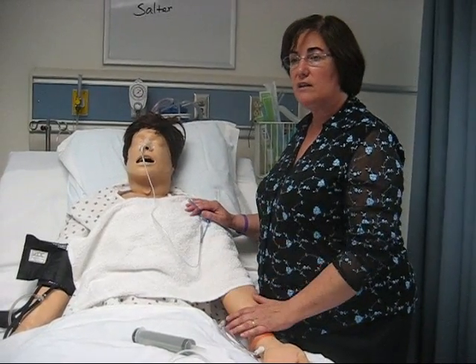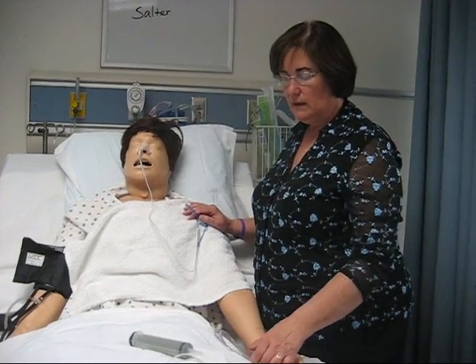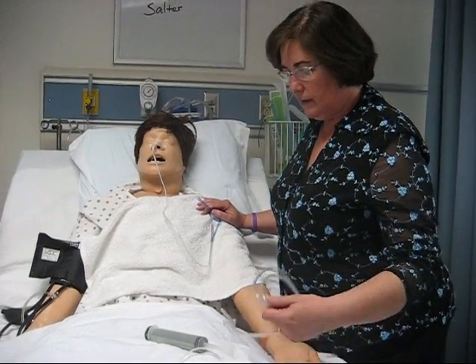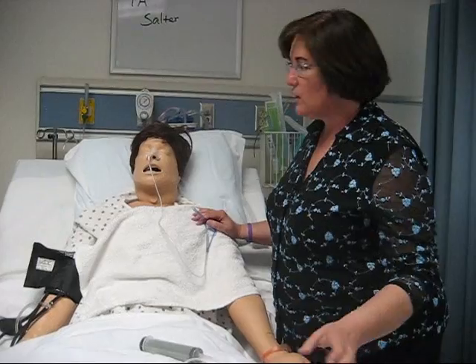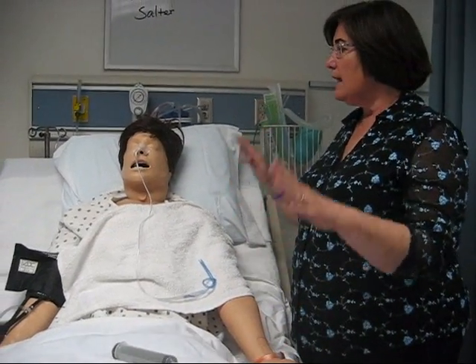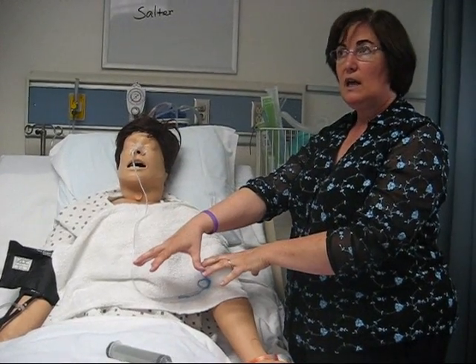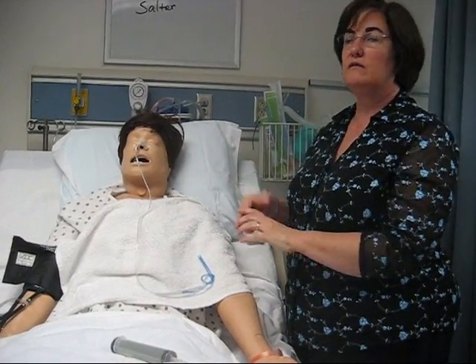And then I actually have to have an order for the actual solution that I'm going to feed them, all right, because that's a dependent function. And now I'm up to the bedside and I'm talking to my patient. I've positioned them, which needs to be this head of bed up business, right? And I'm going to begin with my assessment of the tube, and then my assessment of the abdomen to see if it's appropriate to feed this patient.